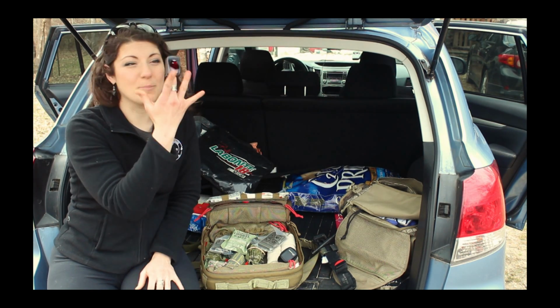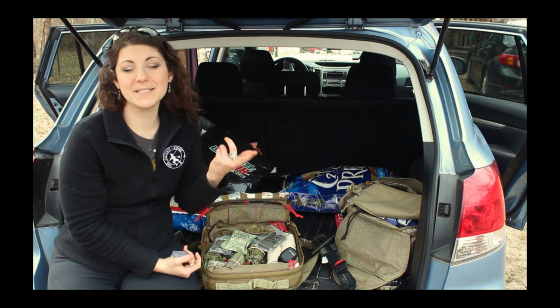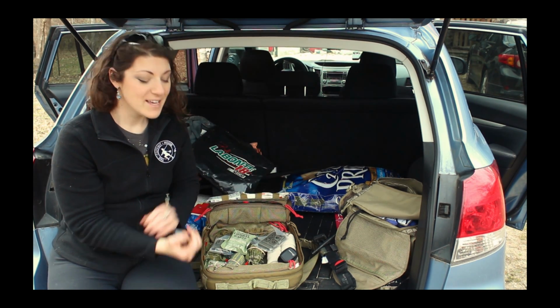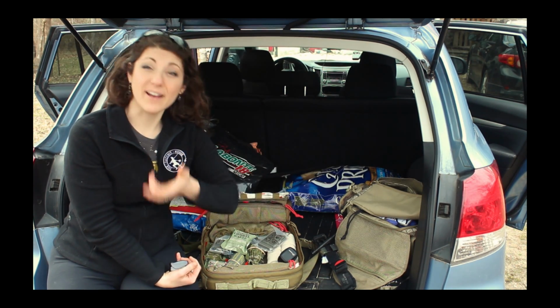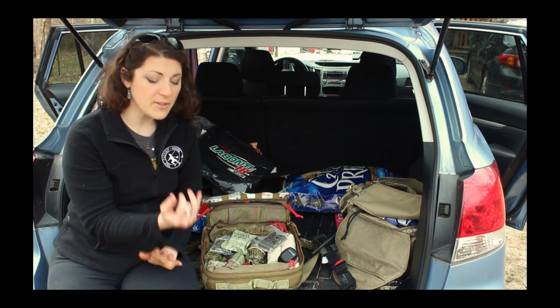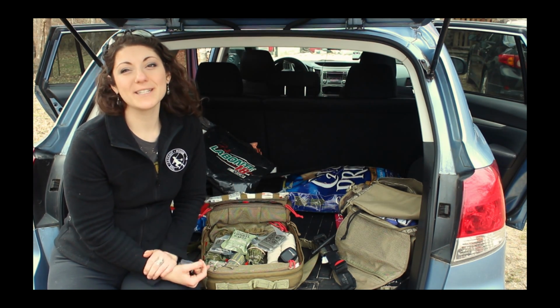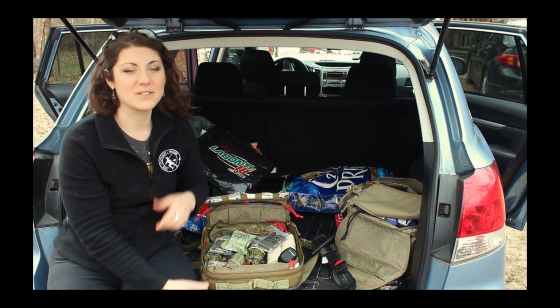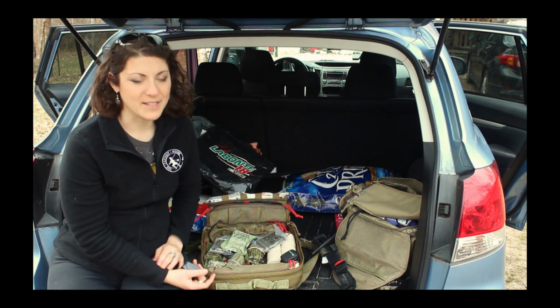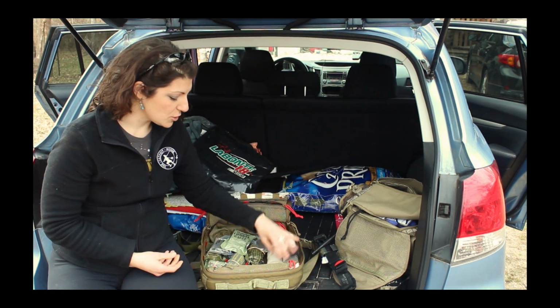Basically, you put this on the finger of a person, and it tells you two things. Number one, it tells you the oxygen saturation of the person, which is how effective their red blood cells are at harnessing and carrying oxygen to the rest of the body. And then also it tells you the person's heart rate. If you're in a dicey situation, it's really nice to have that instant readout, so you don't have to stop and feel for a pulse. It's a good piece of equipment to have in general.